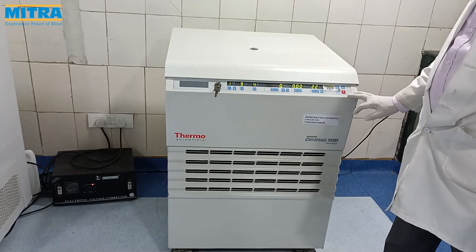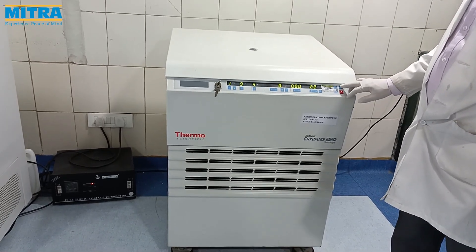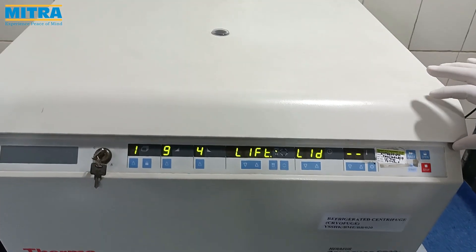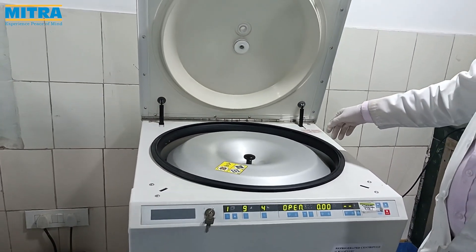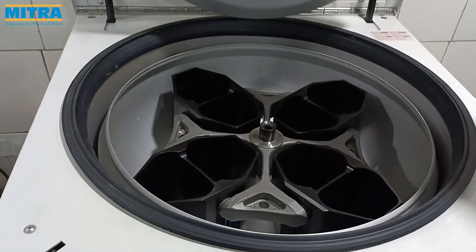Here is our refrigerator centrifuge. As we can see, there is a bucket holder. Now put the bucket packed with the bag into the centrifuge as shown here.